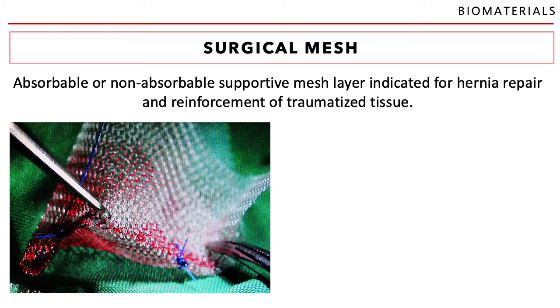Okay? And sometimes when you want to repair those hernias, the muscles that are supposed to wall these holes are too weak. It's like you have nothing left to suture back because they have atrophied or they are too damaged, too friable. So you replace that muscle with a mesh or with a screen.